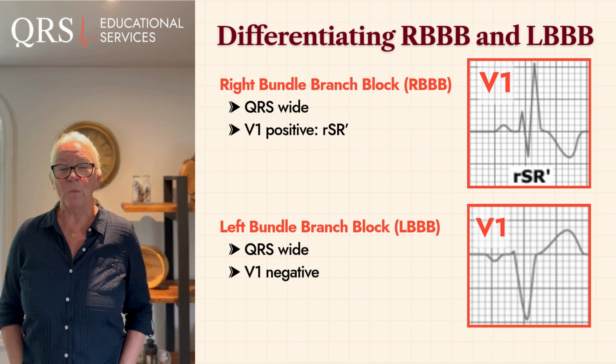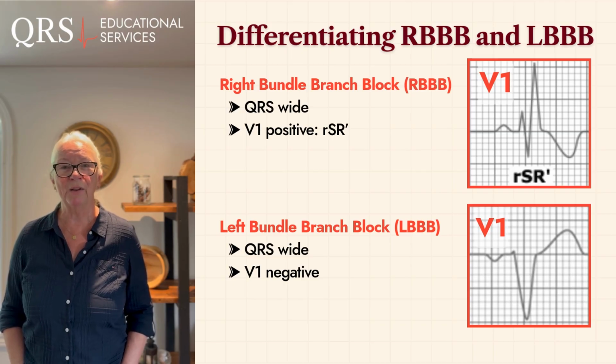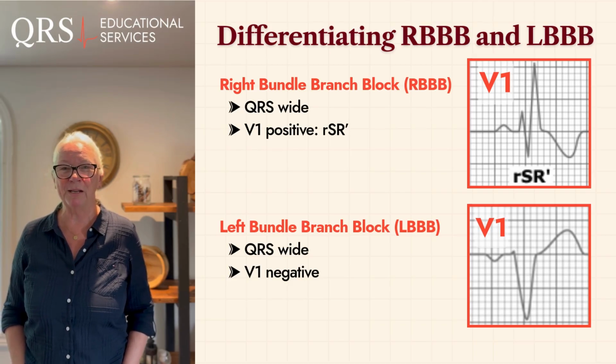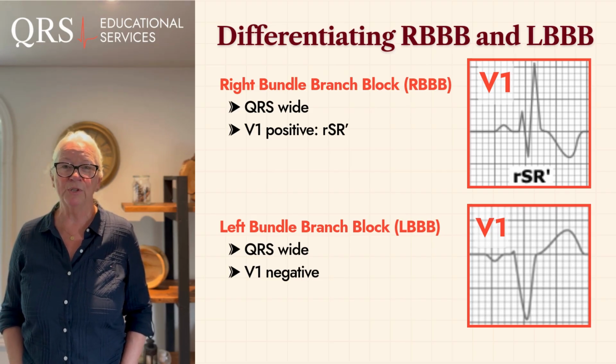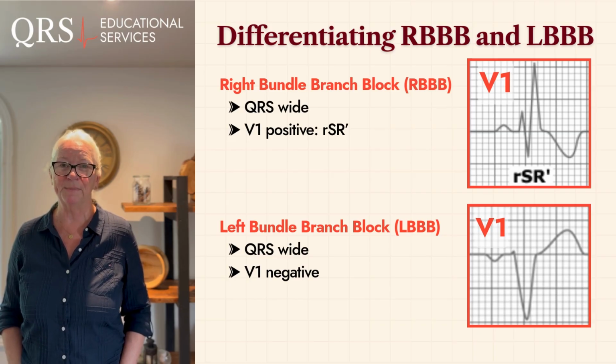There are different ways that patients can present when they are having a bundle branch block, and a lot of times we may just have a hard time remembering the difference between a right and a left bundle branch block. So let's first start talking about how to quickly and simply remember the difference between the two types.